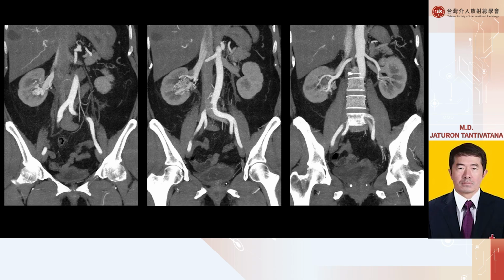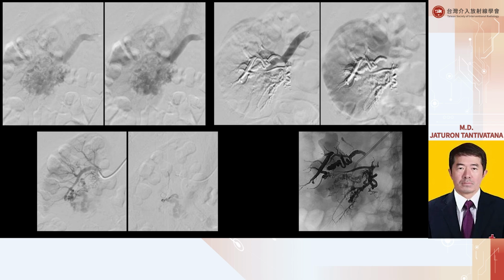There is also the application in body intervention, like in this case of renal AVMs, which had quite a lot of feeders inside. Anyway, this lesion can be embolized with glue or with Onyx. In this one, we chose the example of Onyx, where you fill most of the space with the complex feeders, the nidus, and part of the draining vein, and we get the whole fistula out.